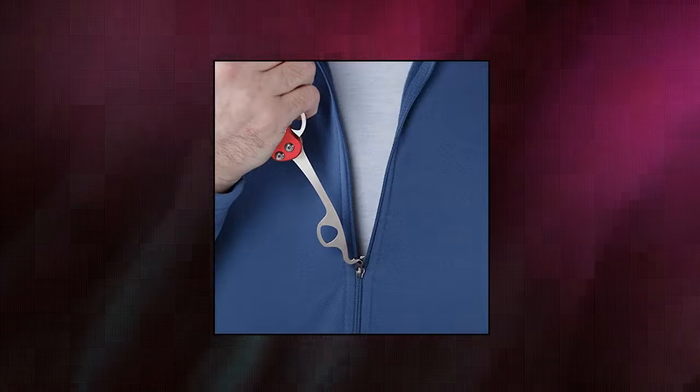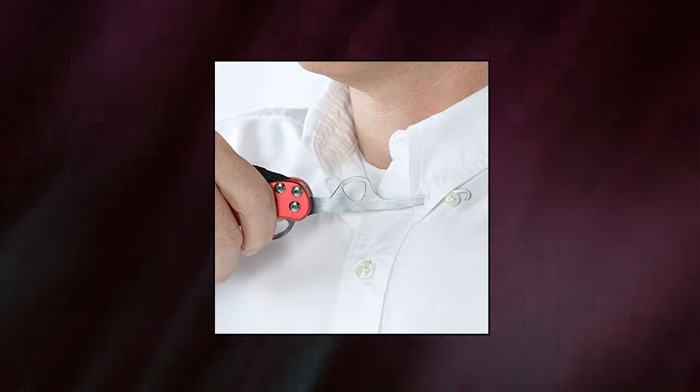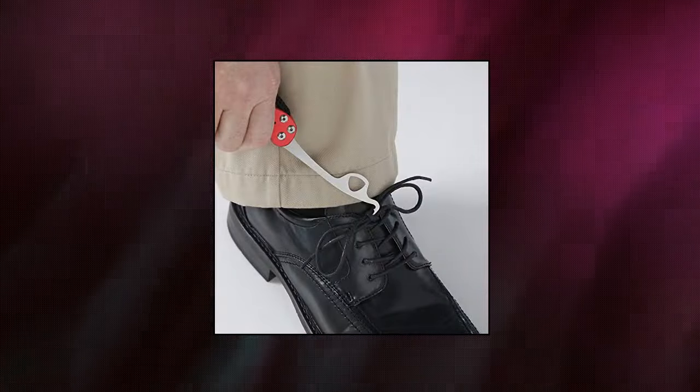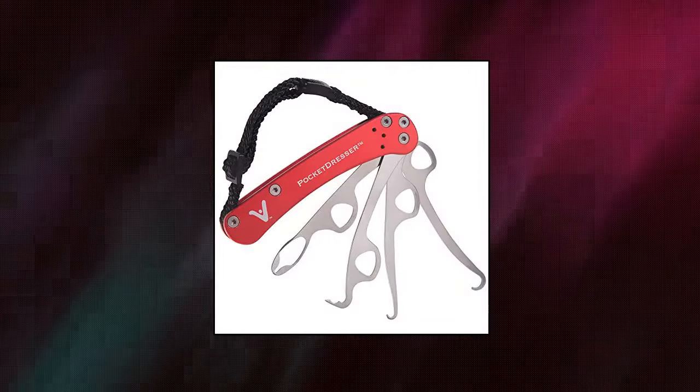Veve zipper pull and button hook pocket dresser and dressing aid for assistance with button hooks, all-in-one dressing tool. Four dress assist tools make getting dressed easier. Pocket assistant features a quick-release hand strap and pocket clip that folds away neatly when not in use.